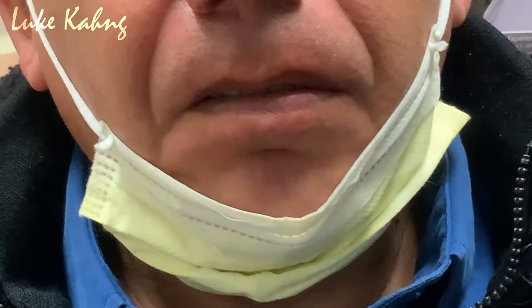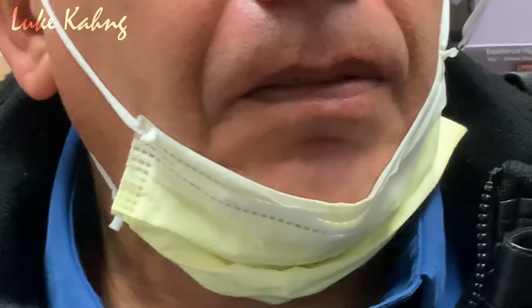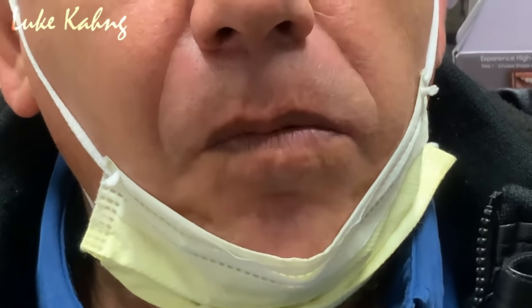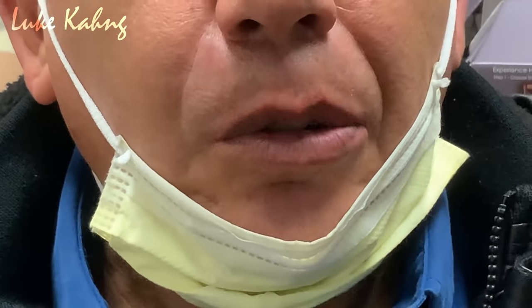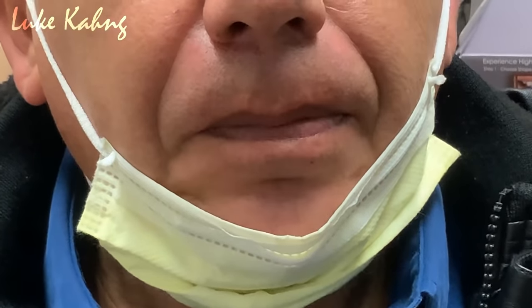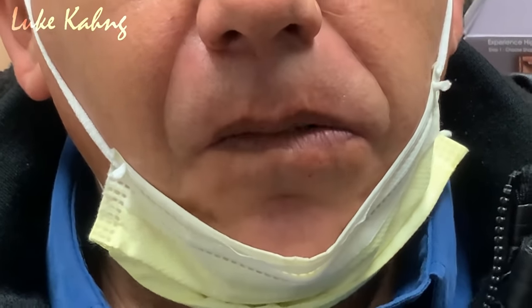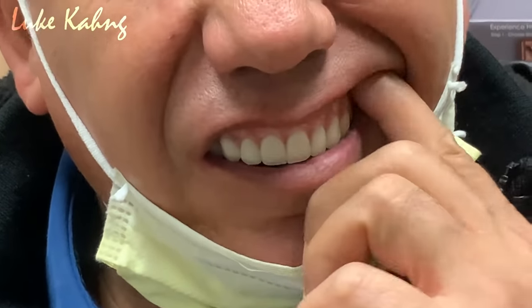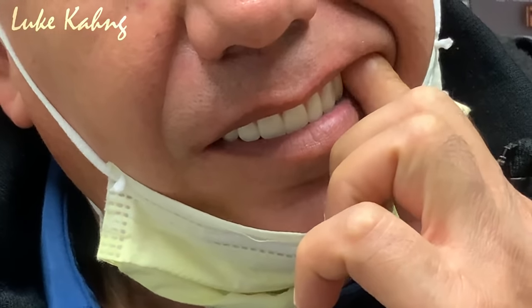Just a little bit weird, just 20, 30 seconds. Hold it. So we could wait for 20, 30 seconds, have him feel it. Because he's not used to these new shoes, for him, the aesthetic is great, right? Aesthetic is beautiful. But now we're talking about fitting adaptations and making the denture more comfortable. I think he said still a little bit over there, right? Still, okay.